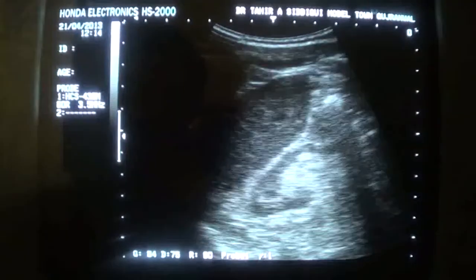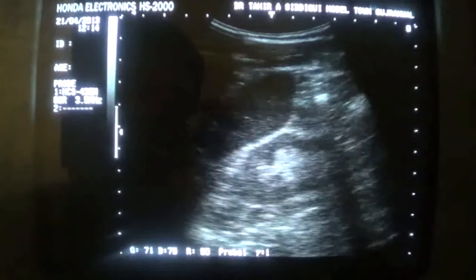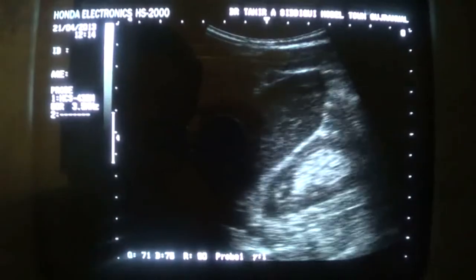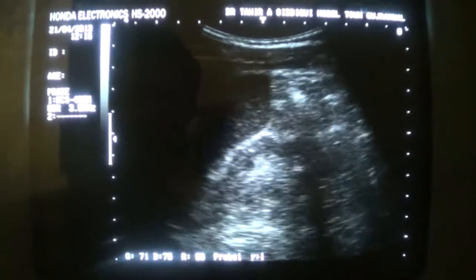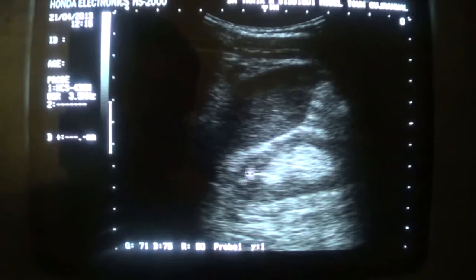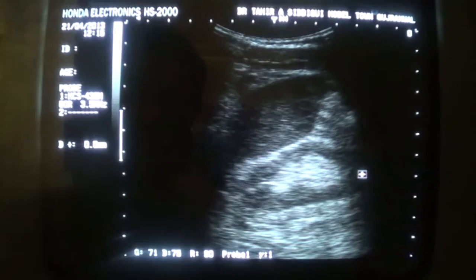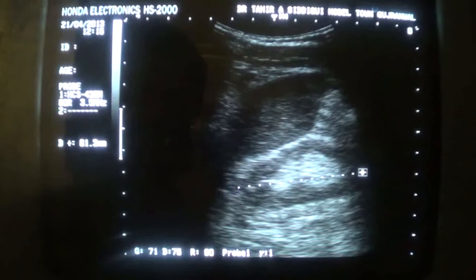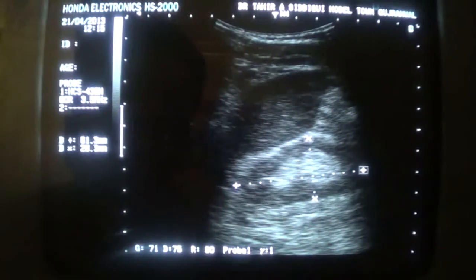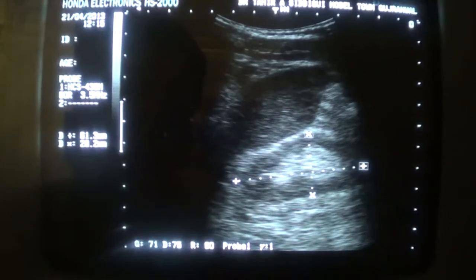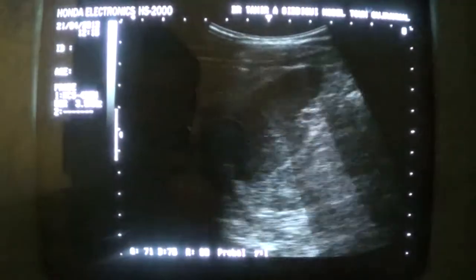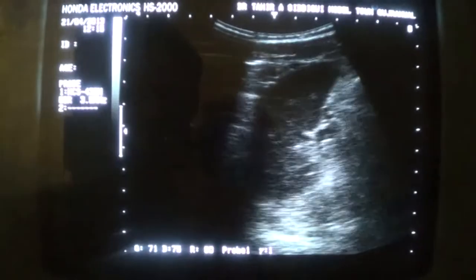Now, this is the left kidney. You can see there is muffling of the corticomedullary differentiation. The size is 6.1 by 2.8 cm, and this kidney is already very small in size. No other significant finding is seen relating to the kidney.